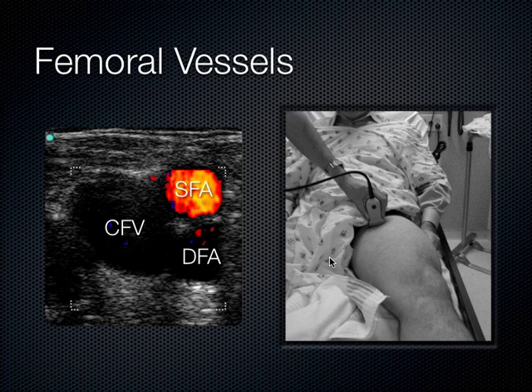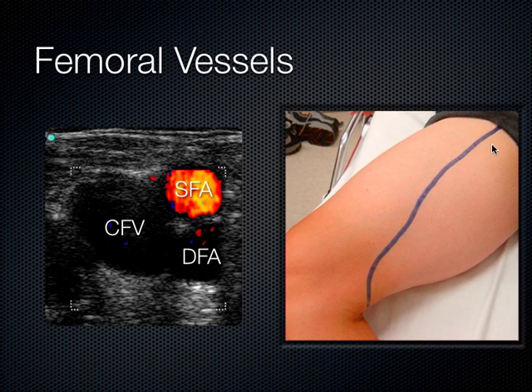Very good, the left leg. The other way you can look at it up here, in the picture, they're scanning the patient's left leg. Very good, excellent. And so what's happening is this femoral vein I drew here on my fellow comes down his leg, and it was a little bit awkward, but it comes down his leg and dives in the superficial femoral canal. This is where it's really hard to insonate or to view.